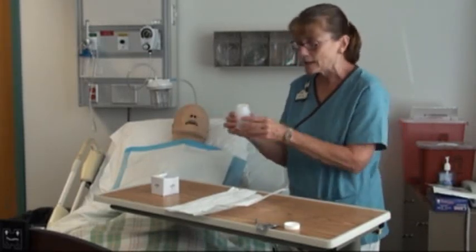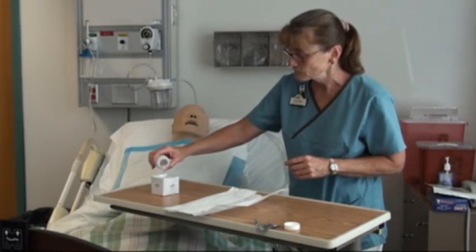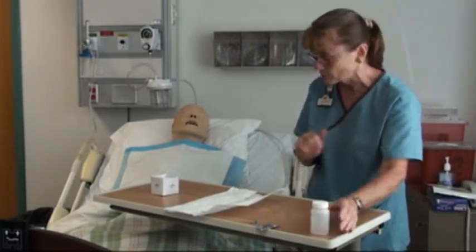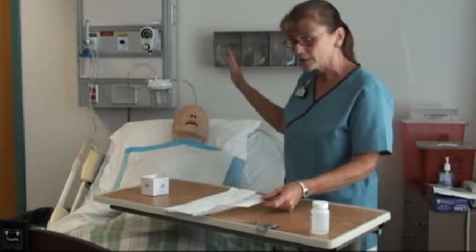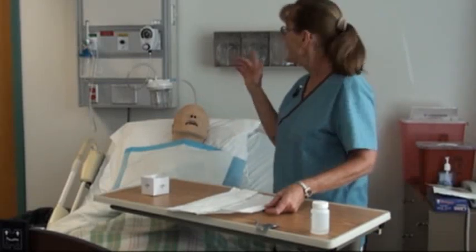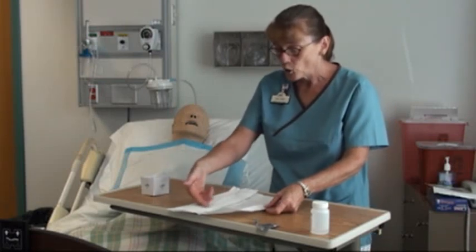Label's in my palm so if the label's not waterproof it won't smudge. Go ahead and put your lid back on because we're finished with that. Now we're going to turn our suction on. On this particular model, 80 to 120 is your medium suction. We're going to leave it on continuous because once we get down, we want to go ahead and suction out.